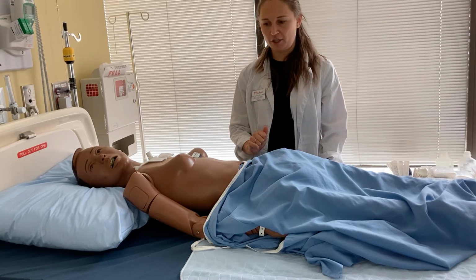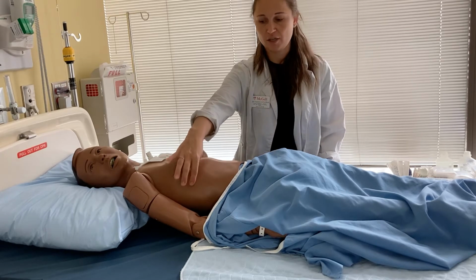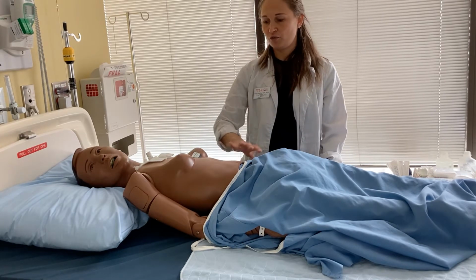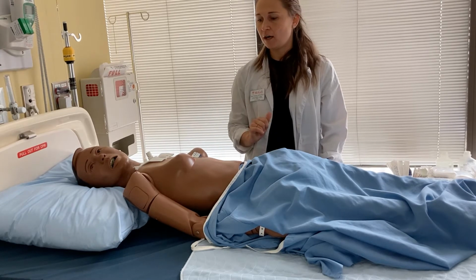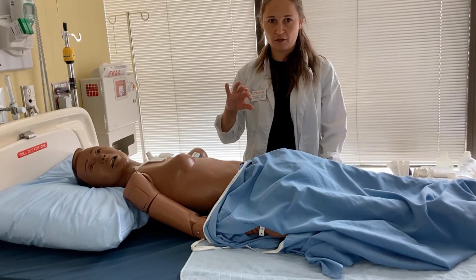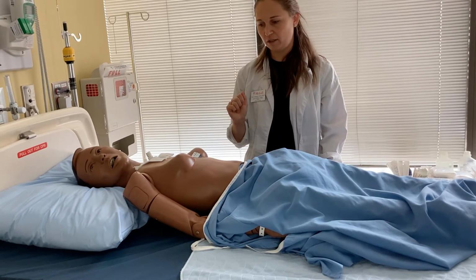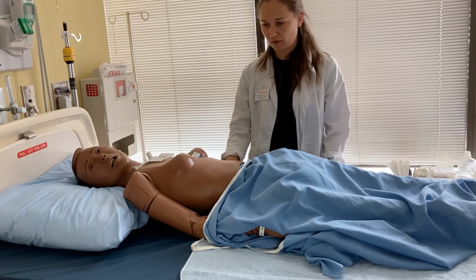A right-sided EKG would be done on the right side of the patient's chest, very similar to the left-sided EKG, and that will really visualize the right ventricle of the heart. A posterior and a 15-lead will be looking more at a posterior and lower bottom of the heart. So I will show you how to do a 15-lead first.